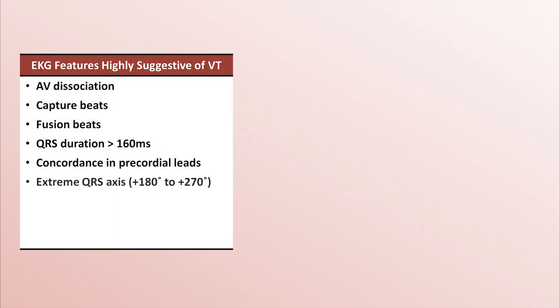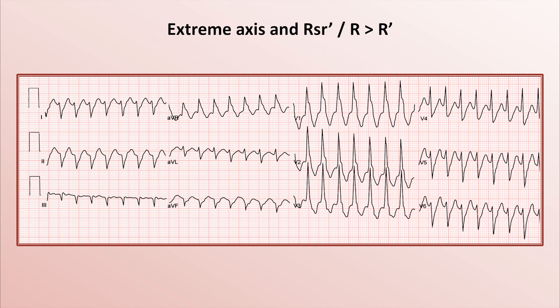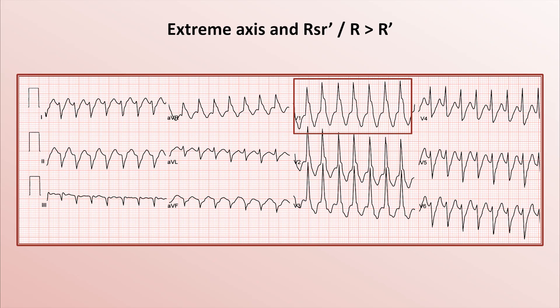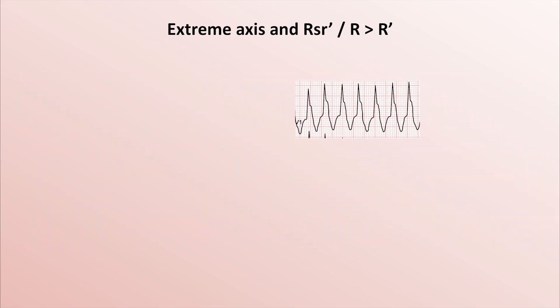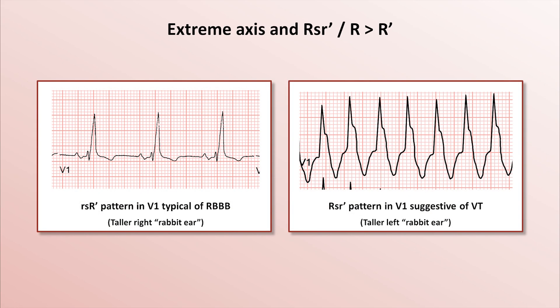Two more features are an extreme QRS axis, also known as a right superior axis, between positive 180 and positive 270 degrees, as well as a finding sometimes described as R greater than R' in V1, or more colloquially, a taller left so-called rabbit ear. The extreme axis is demonstrated by negative or down-going QRS complexes in both lead I and AVF. Regarding the rabbit ear, look at V1 and see how there is a left-sided peak to the R wave with a notch or shoulder on the right. While an RSR' complex or rabbit ears in V1 are a typical feature seen in right bundle branch block, in that case the right rabbit ear is taller. When the left rabbit ear is taller, it's suggestive of VT.